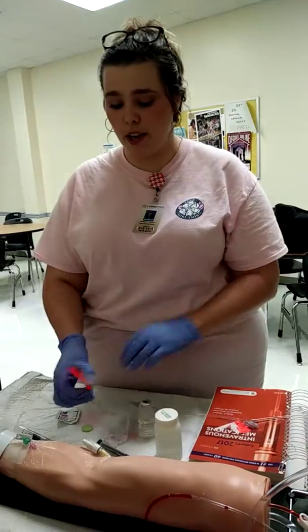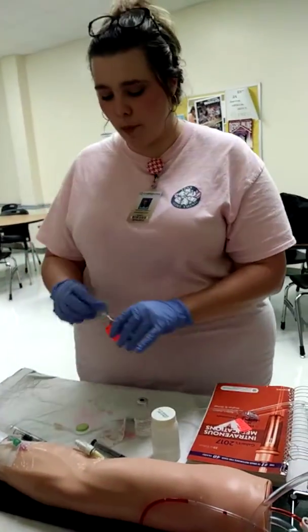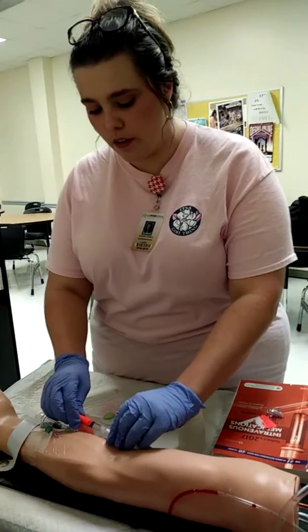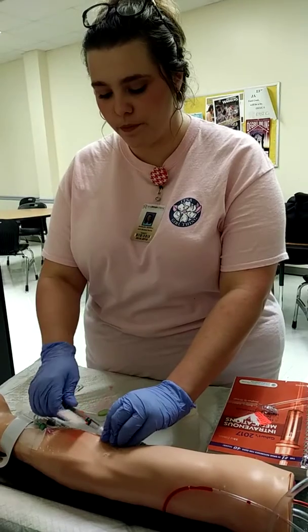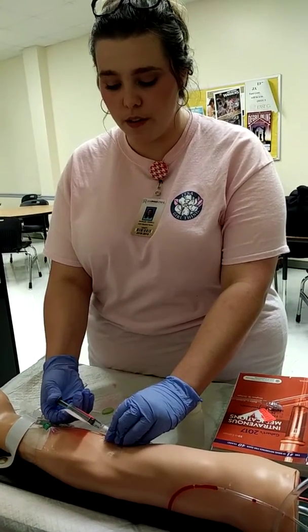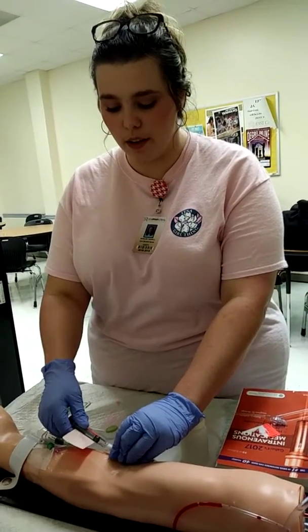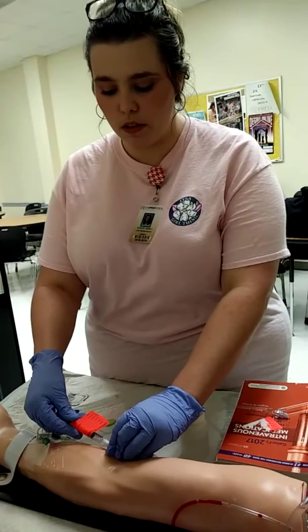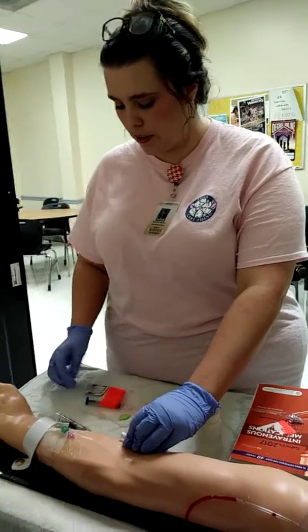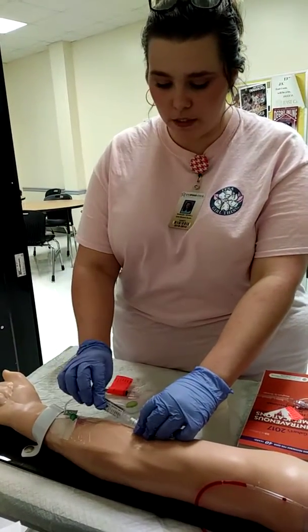So now I'll get my medication that's labeled. Go ahead and unhook it. I'm going to clean it. I'm going to clean the last bit. And then I'm going to connect it. And then I'll push over the 2-minute period, which is, like I said, half a mil every 30 seconds. Once that's clean, I'll make sure to flush again.